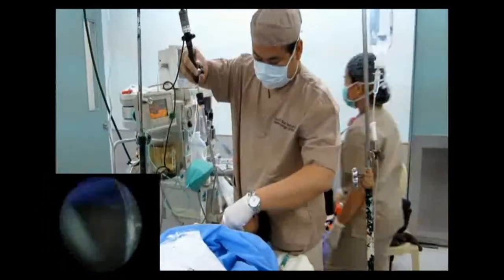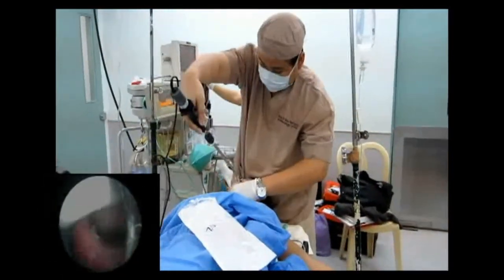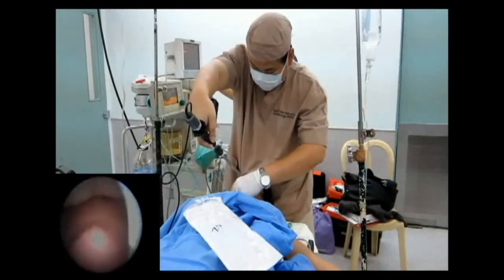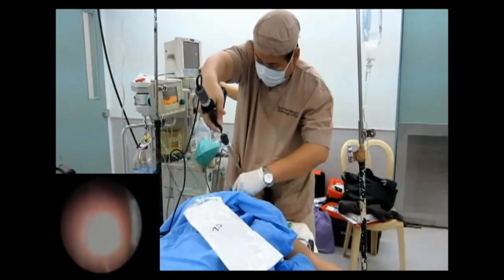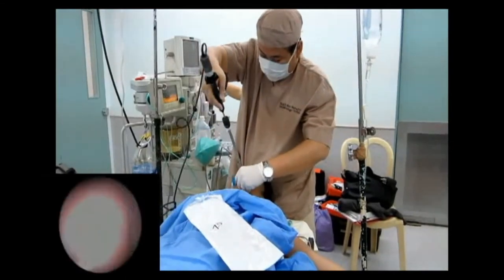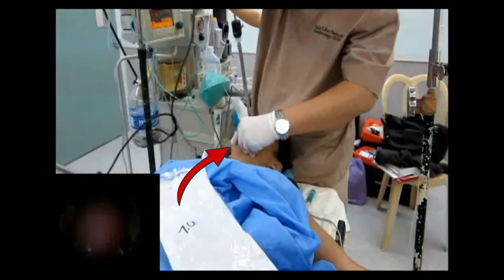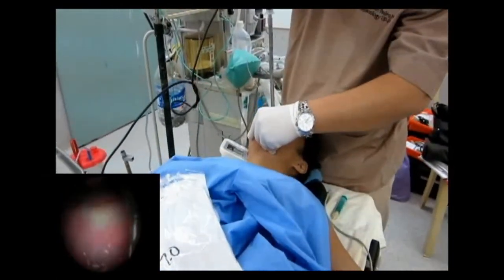When you're used to the procedure, you can use your non-dominant hand to lift the mandible with your thumb and index finger. Use the thumb holding the mandible as an indicator for the midline. As long as the scope is touching your thumb, you know you're in the midline.